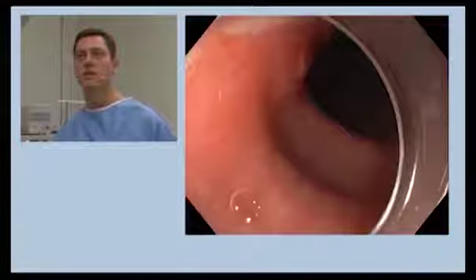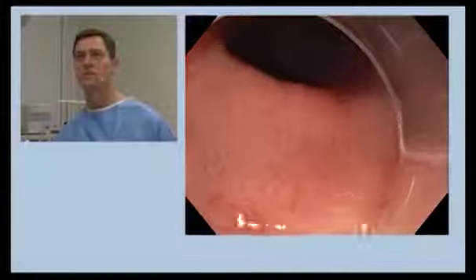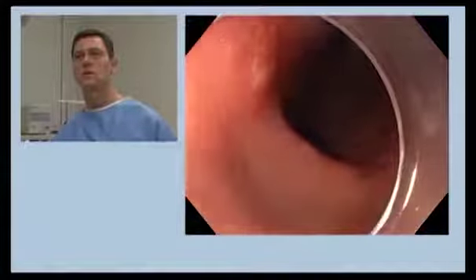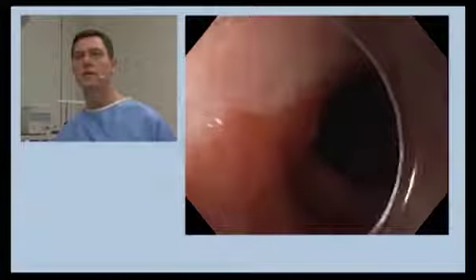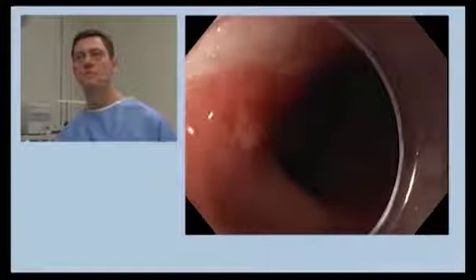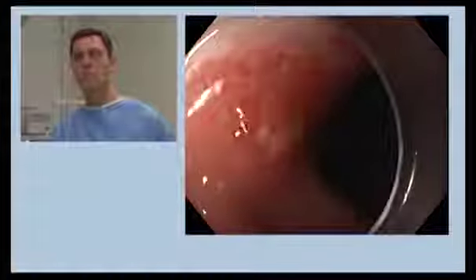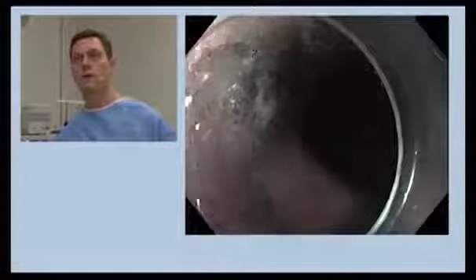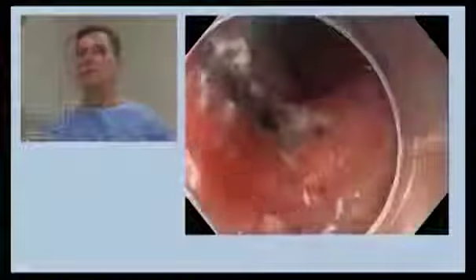Here in this half of the circumference, it looks very, very good. It's regular epithelium. You can hardly see any capillaries coming through. And now, here next to the re-epithelialized resection surface, a very small area appears. And now we want to look at it with NBI. And it's got very slight inflammatory changes.